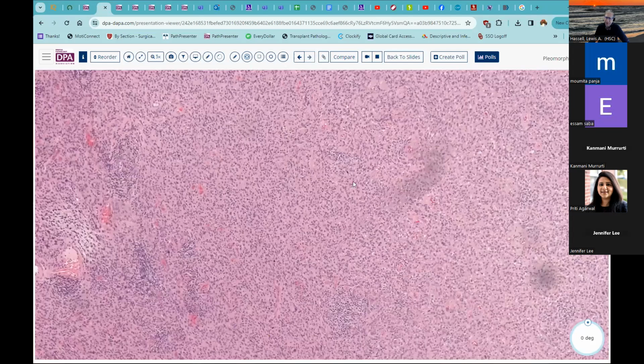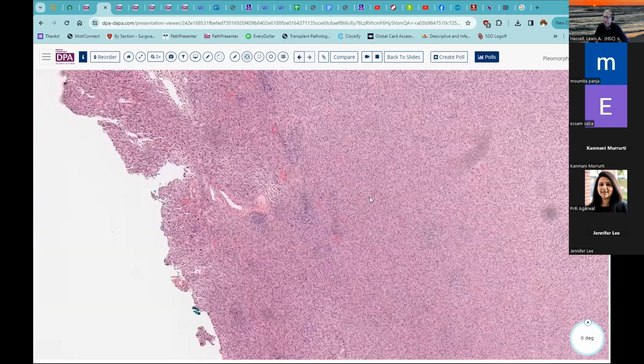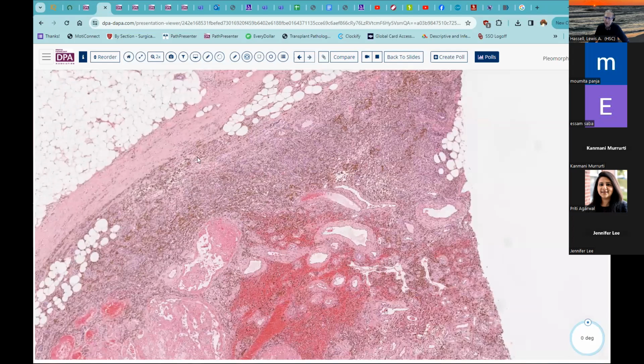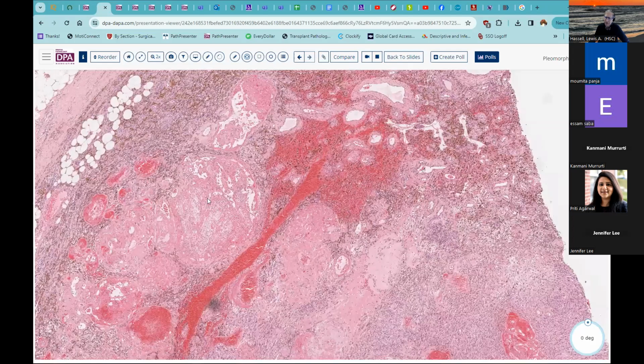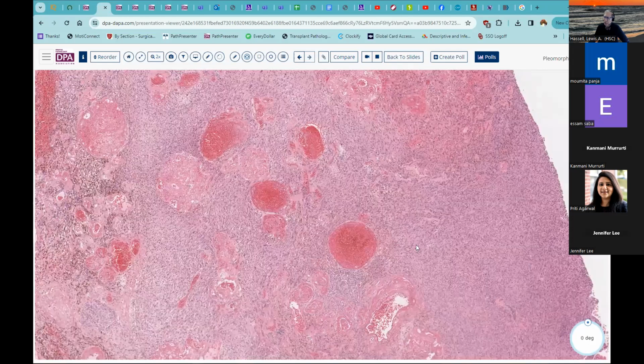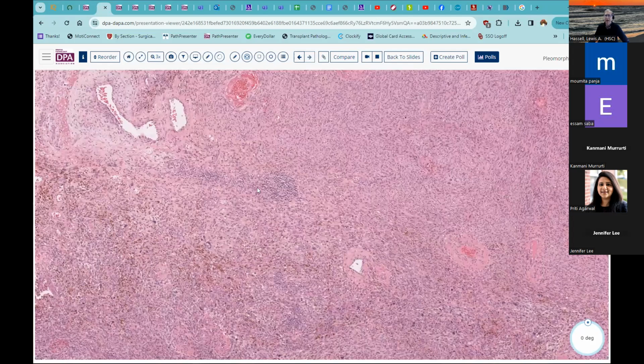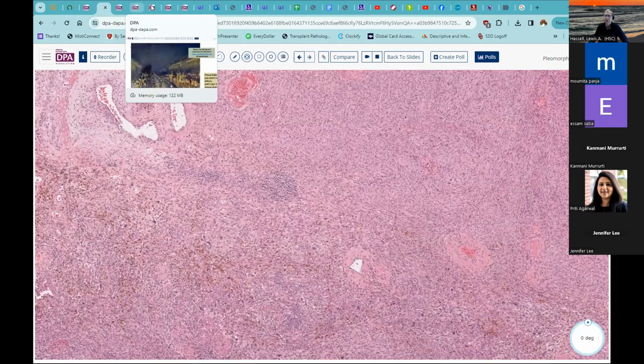And those are, again, more uncommon lesions as well. So I think it's just nice to see some of the spectrum of disease in this type of tumor and consider what you might do with biopsies that include variable amounts of this kind of process. Here you see some of the inflammatory infiltrate that we can see with this lesion.